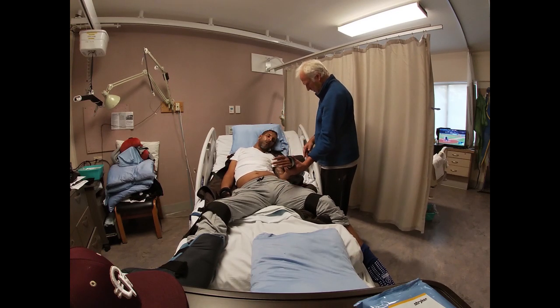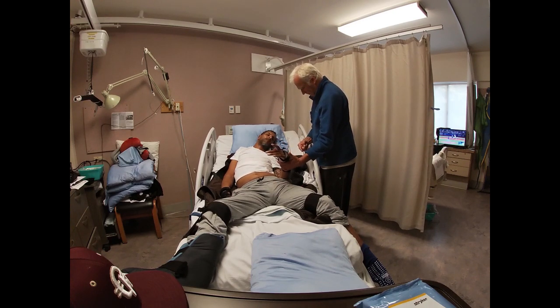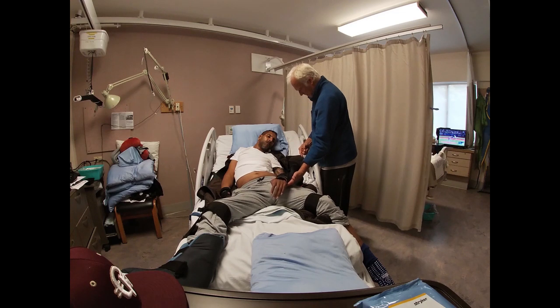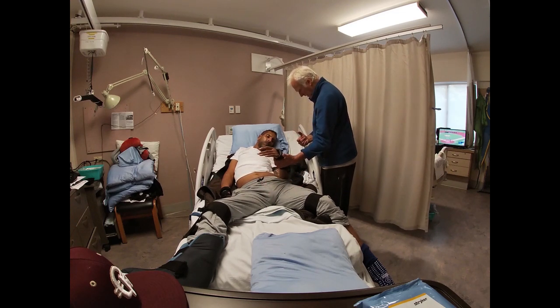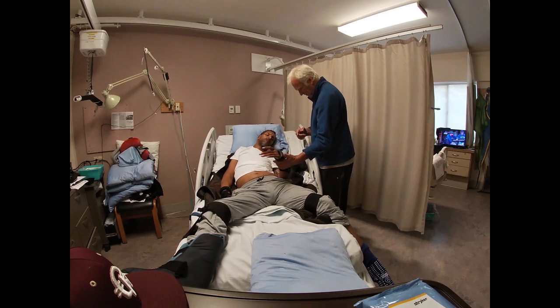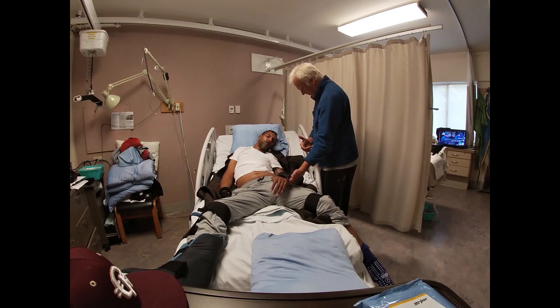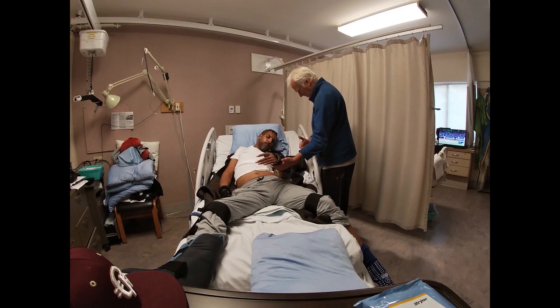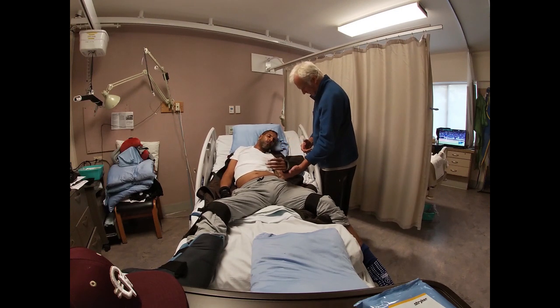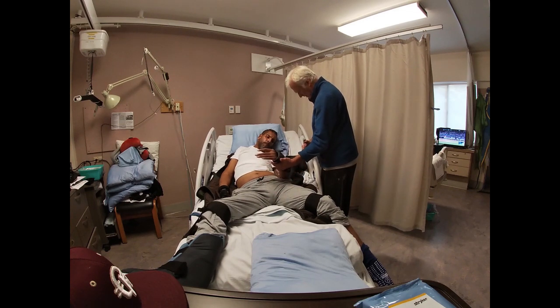Okay, bend the elbow. Bring your hand up. Up, up, up. And straighten the arm. Let it fall down. Okay, now bring your hand up. Good, good, good. And down. Let it go down. Okay, bring the hand up. Up, up, up. That's it. Good. So you've got some good deltoid, some biceps going there. Okay, and again. There you go.